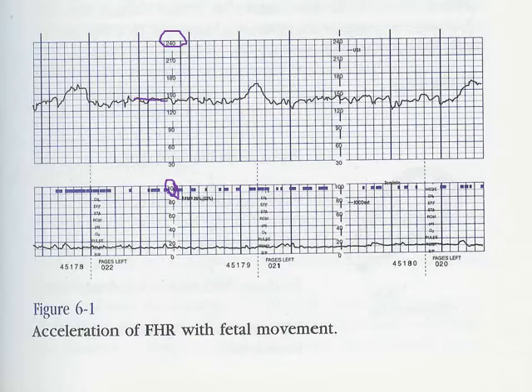All right, if you said 135, 140, I would agree with you. It's about 135, 140. Some people say 135, others 140. Either one is fine. Okay, so good. So now we're going to determine what about the acceleration. It has to raise how many beats per minute above baseline? 15? Yes, let's see if this acceleration does that.